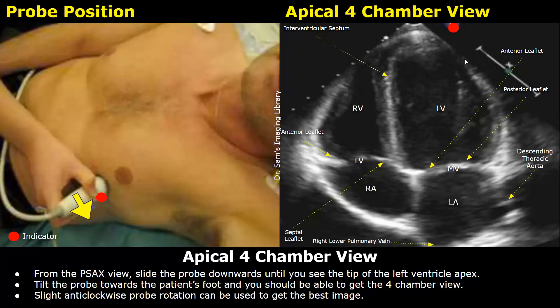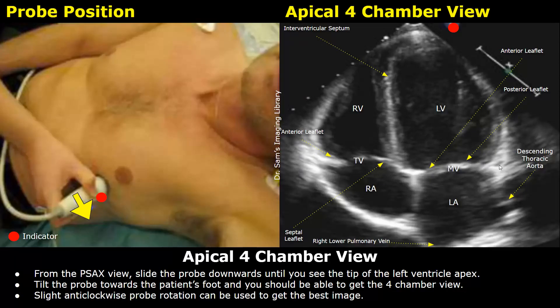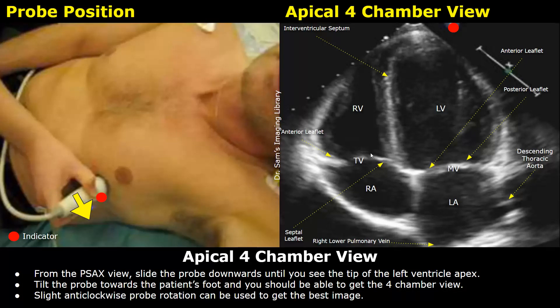In the four-chamber view image, the left atrium and ventricle are seen on the right side, and the right atrium and ventricle are on the left side. The left atrium and ventricle are larger than the right. The mitral valve is seen between the left atrium and ventricle — the posterior leaflet is attached to the left ventricle wall and the anterior leaflet to the interventricular septum. The tricuspid valve is between the right atrium and ventricle — its anterior leaflet attaches to the right ventricle wall and the septal leaflet to the interventricular septum. The descending thoracic aorta is visible near the left atrium, and the right lower pulmonary vein is also seen.